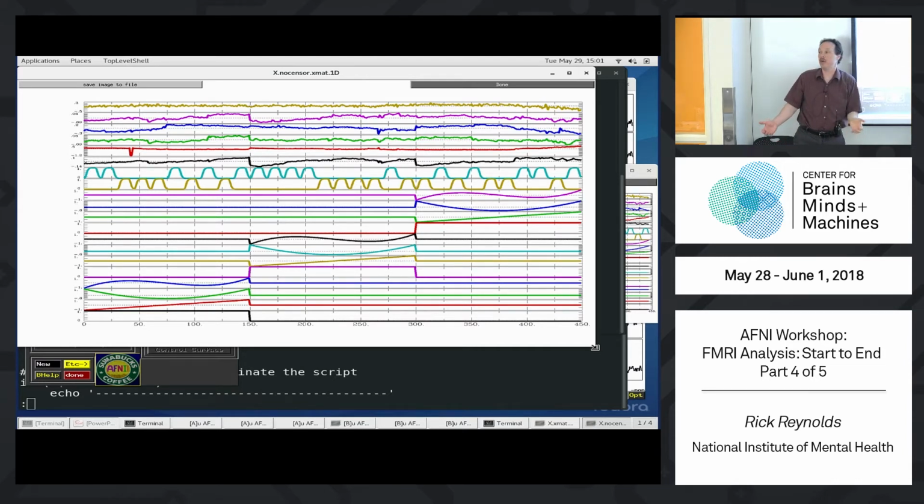The results should be garbage. But if you do it in a magical pre-processing step, you don't notice those degrees of freedom disappearing, and you don't remove that from your other regressors, so you're not handling it properly, and you still get a result. So it's better to put it in one model so you know exactly you're accounting for everything.